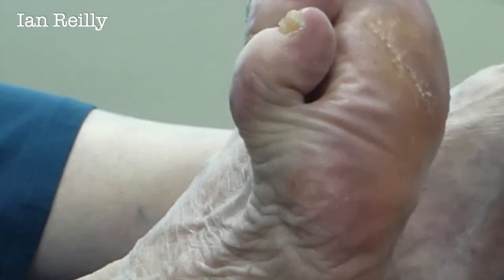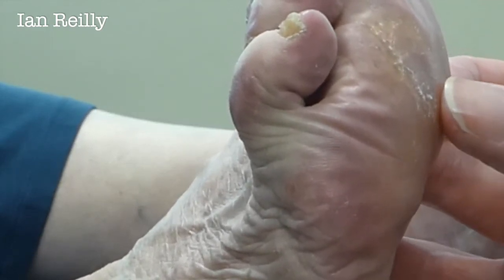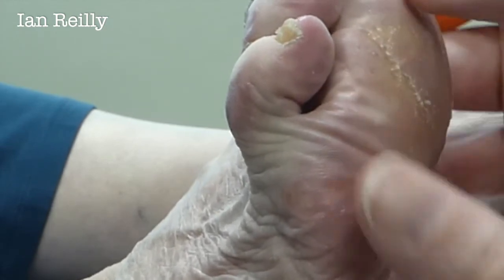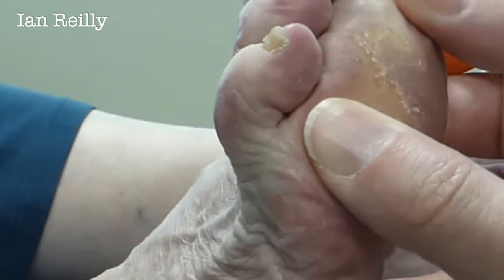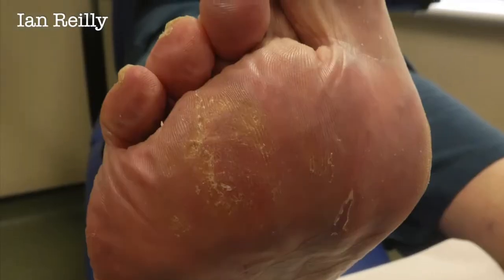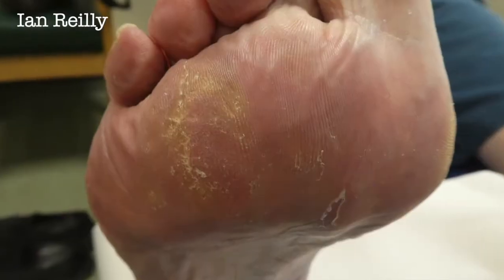So this is going to be our pre-injection video just to kind of demonstrate the clinical application of this — particularly anterior three and four, and you can see you've got this fairly uncomfortable punctate seed corns, heloma miliare in old money. Here are a couple of close-up photos of the foot looking at the plantar surface.